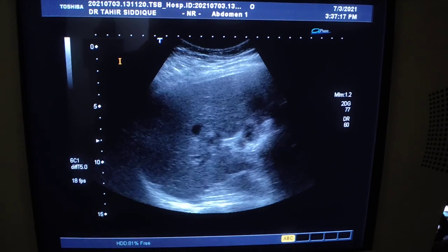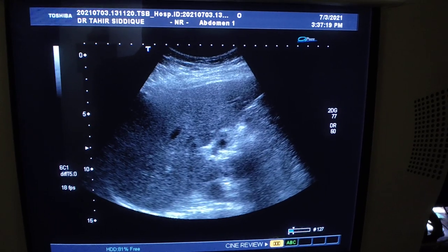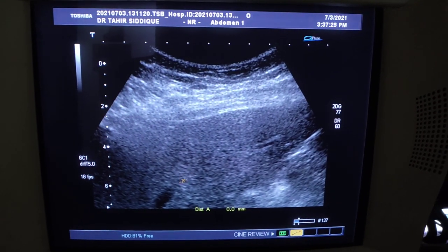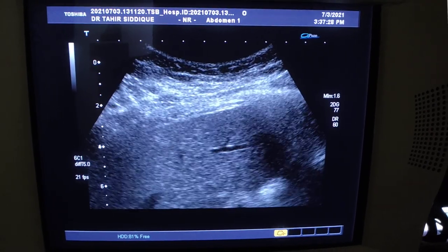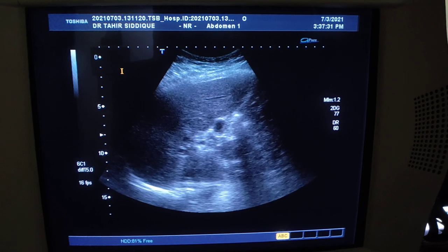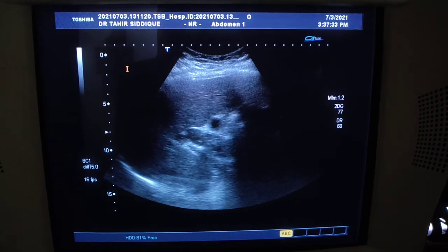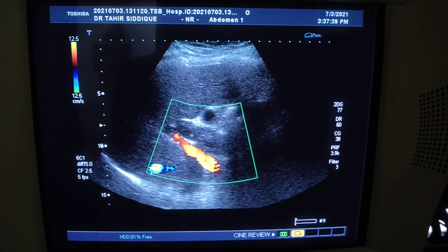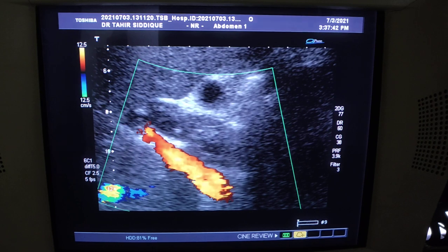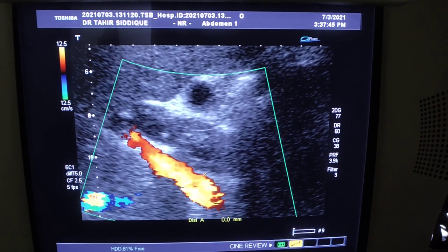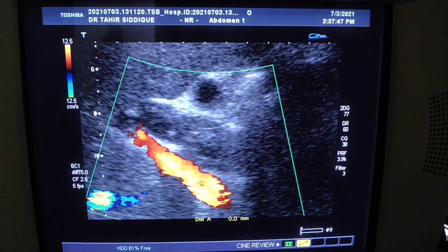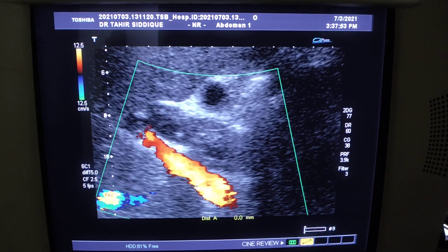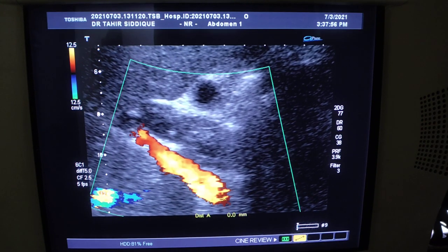Now moving towards the liver. The liver is normal and unremarkable — normal smooth outer surface and smooth parenchymal echogenicity. Here you can see the portal vein. The next pathology I am going to show has nothing to do with the pelvic pathology of hematometra in this patient — it is an isolated other pathology.